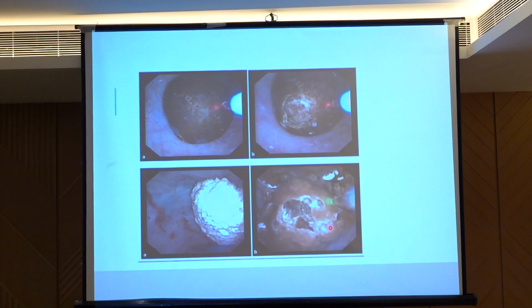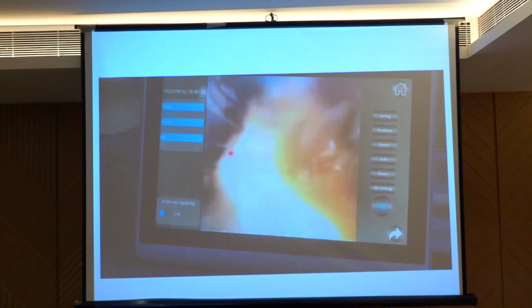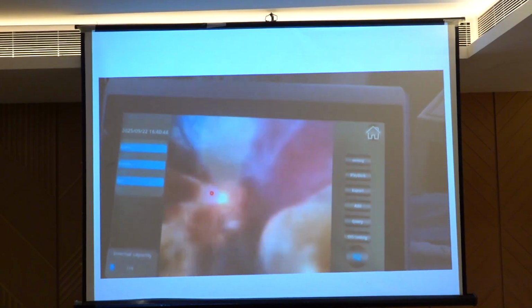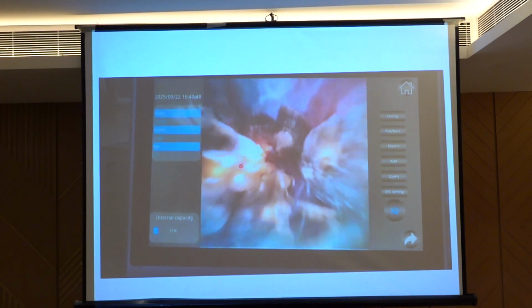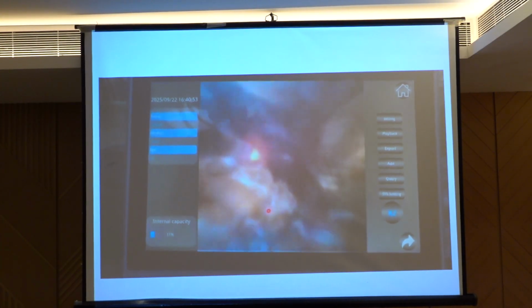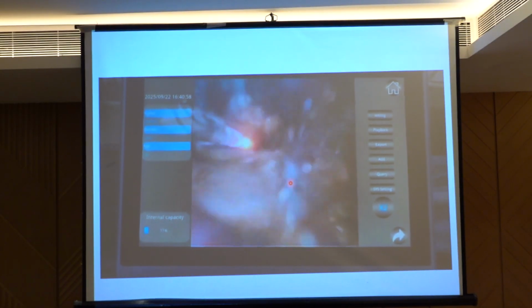Now in patients where there is a larger stone that may not be amenable to a single retrieval, we use a holmium laser to make multiple fragmentations of this stone, and then individual fragments can be brought out. Here we are using a holmium laser with a 200 micron fiber, and we are demonstrating how we are fragmenting the stones into smaller fragments. As you can see, this one fragment has just gotten loose over here, and subsequently each of these fragments is dusted into small parts and then retrieved.